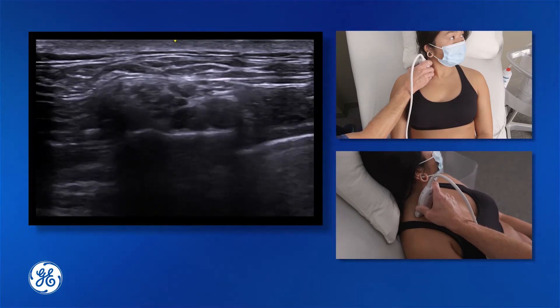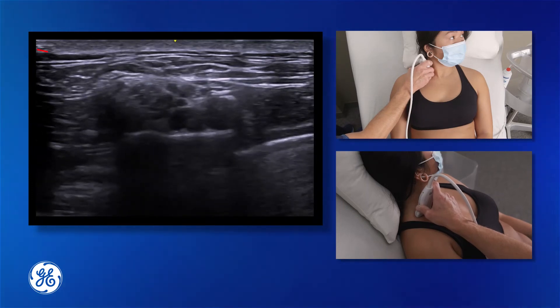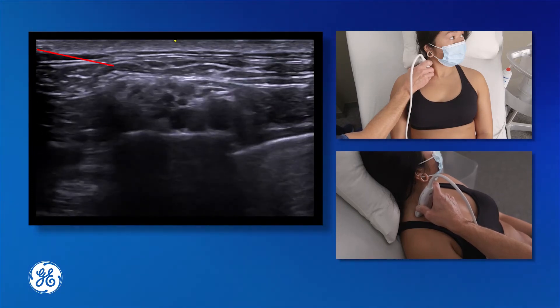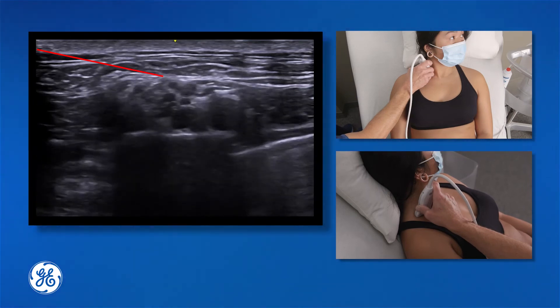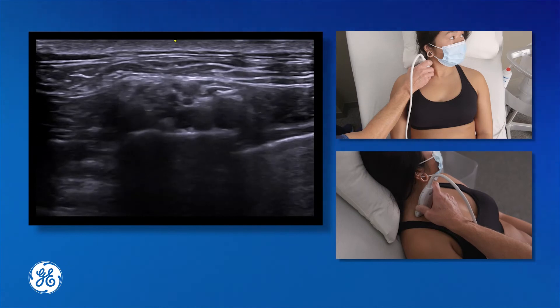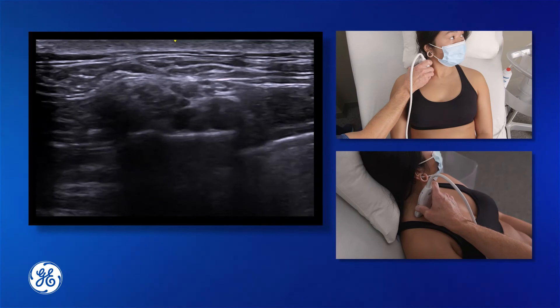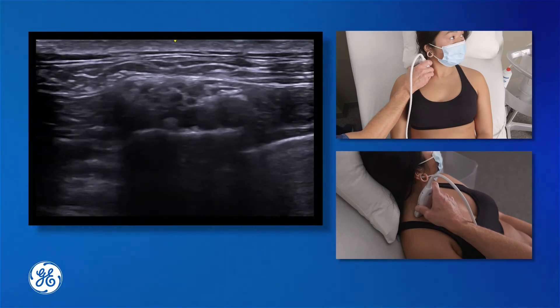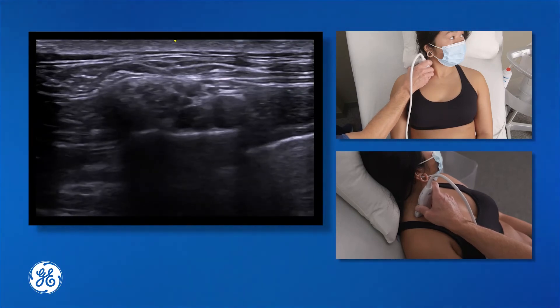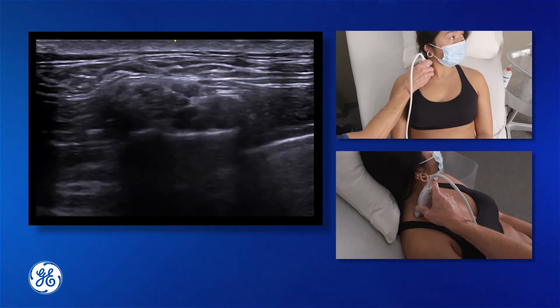We're going to do our first entry point into the sheath, hydrodissect through, and position the needle to see good coverage. You may need to bring the needle back and position it anterior to the plexus to fill the sheath. 20cc's of local anaesthetic is normally a sufficient amount to completely encapsulate the sheath and give a great block of the brachial plexus, sufficient for surgery of the forearm or the hand.